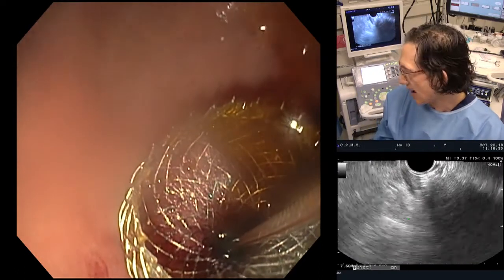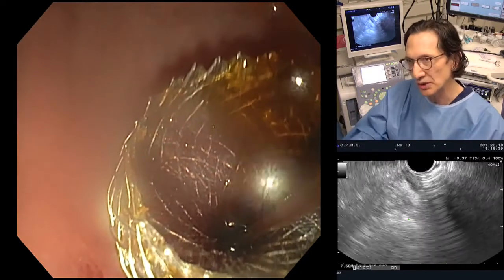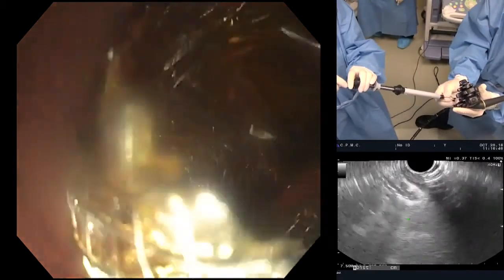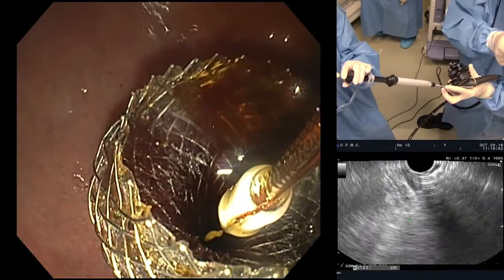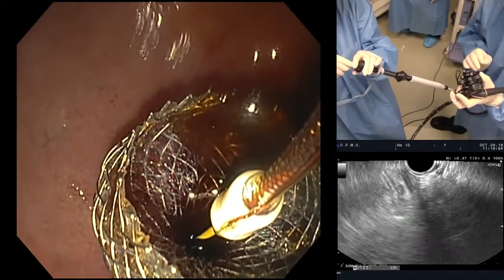So now I'm going to have the assistant advance the wire as I pull off. So you can see on the screen here, please, on the handle, down on the handle, I've un-Luer locked. I am pulling out. Now, look at the tip here. See, I told you about the micro wires. Do you see that micro wire running along the very tip? So this is true engineering genius.